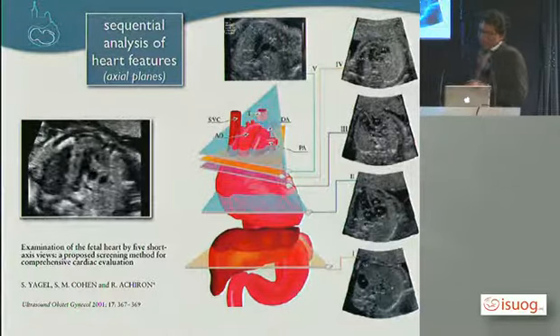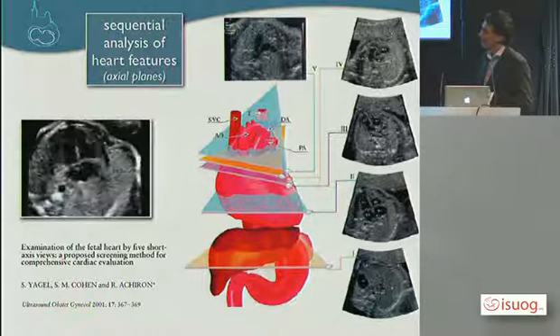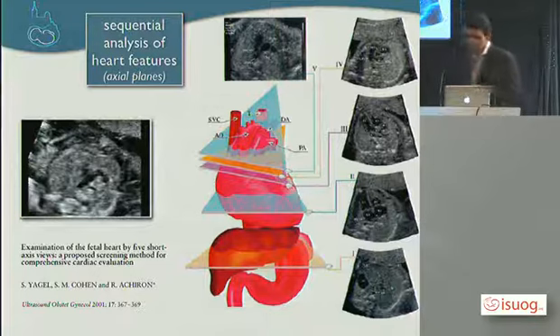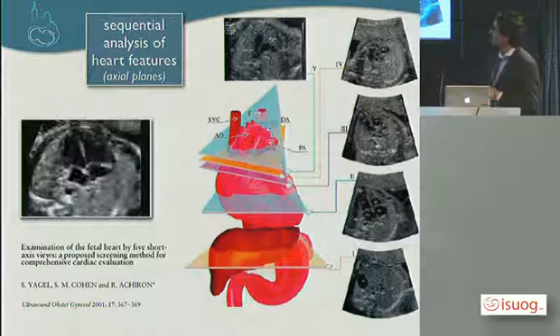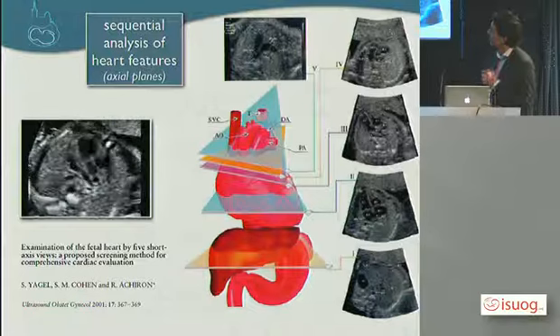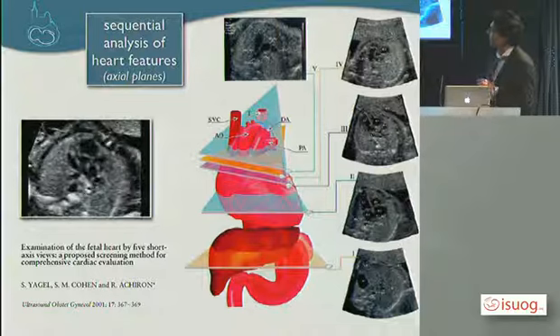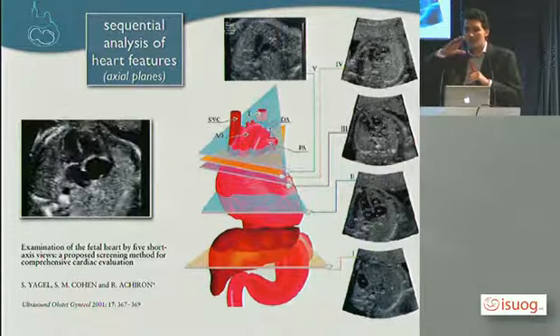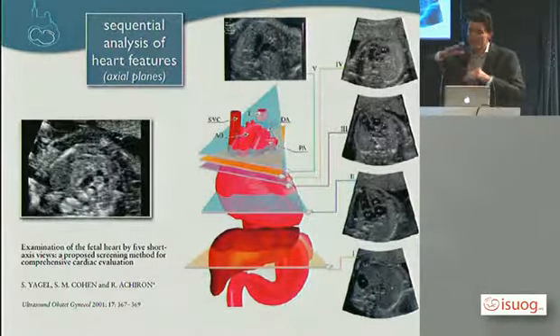Then the next slide is to speak about how to facilitate the assessment of the fetal heart, always trying to increase the pickup rate of CHD. Simcha Yagel proposed several years ago a way to facilitate the fetal heart examination. Julien has said before, Dario as well, and I will try to explain a little bit more. You can make 5 parallel slices. You don't have to tilt up on the upper side, on the left side, on the right side. Just make parallel slices like a sweep.